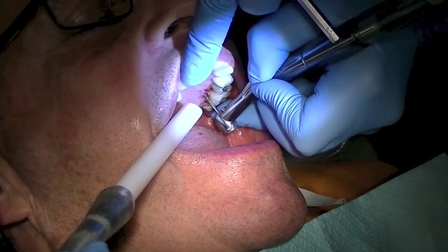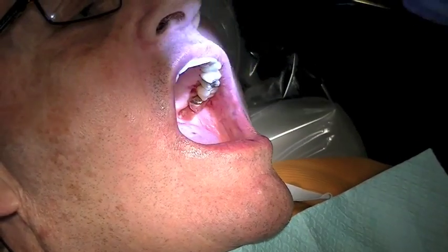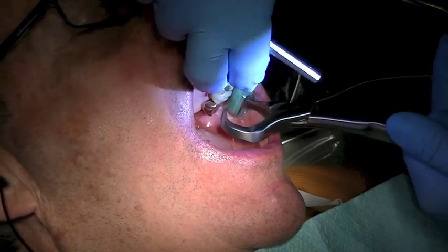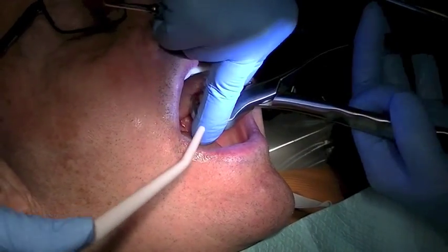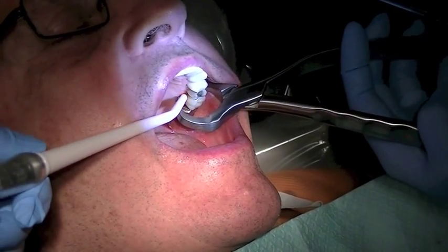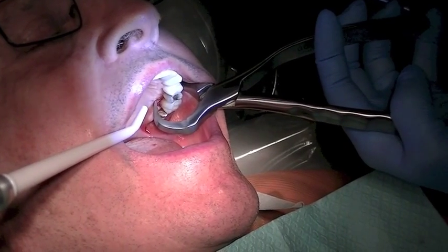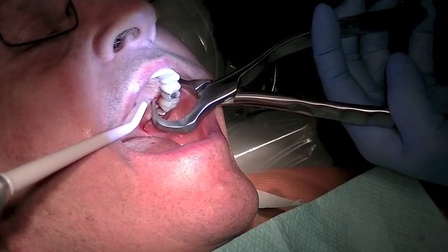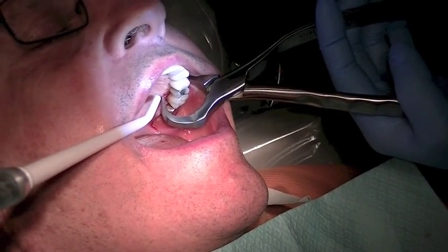I'm not taking any bone away, I'm just flattening the palate there. Once again I reposition my beak and my bumper. I made that flat on the palate enough to cover the width of the beak.